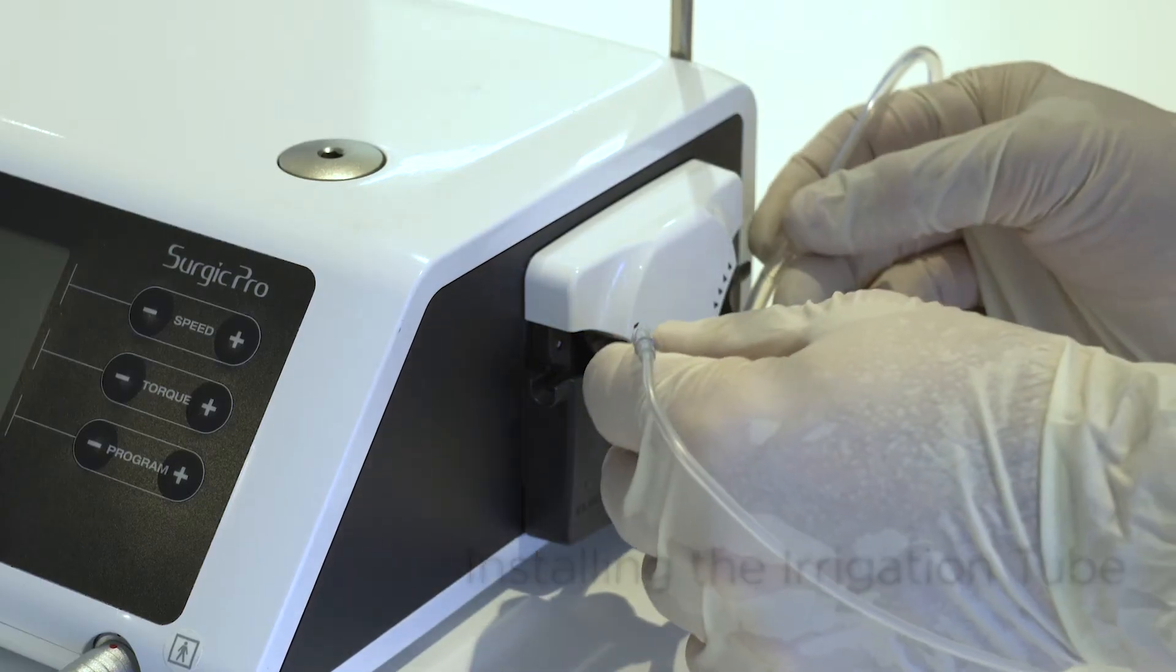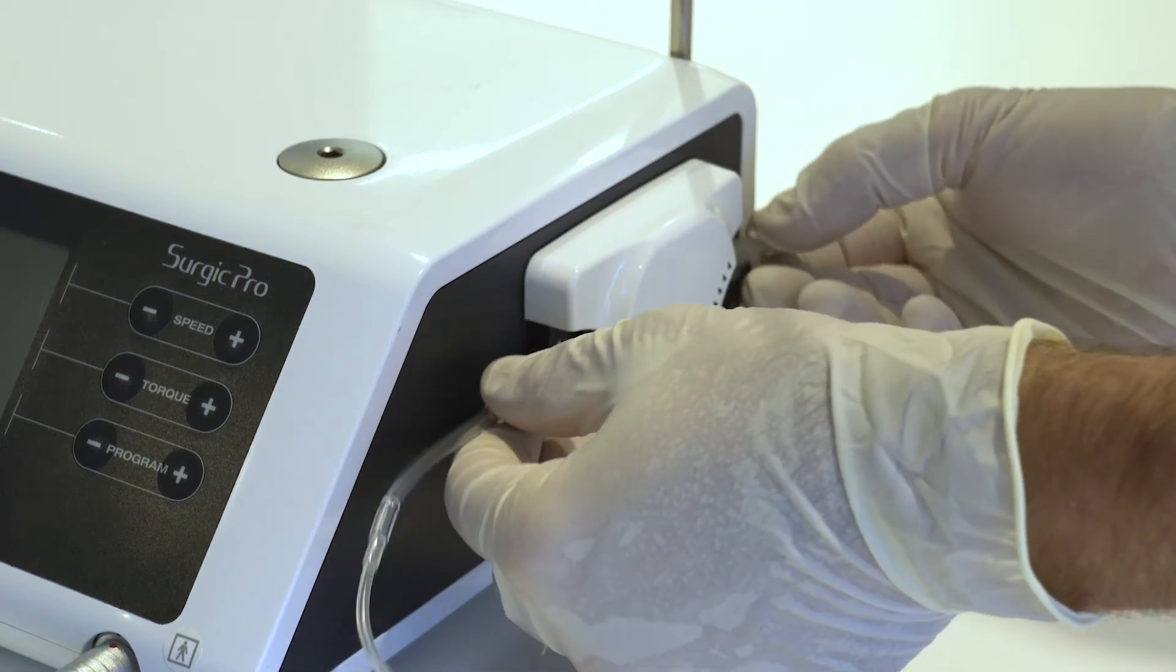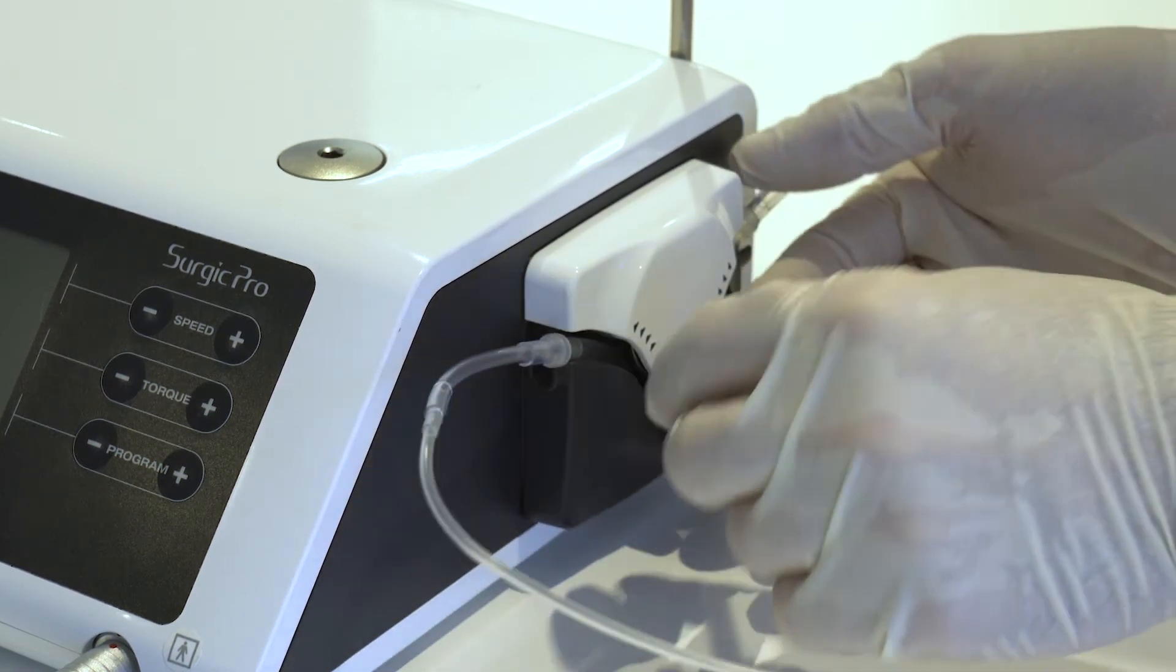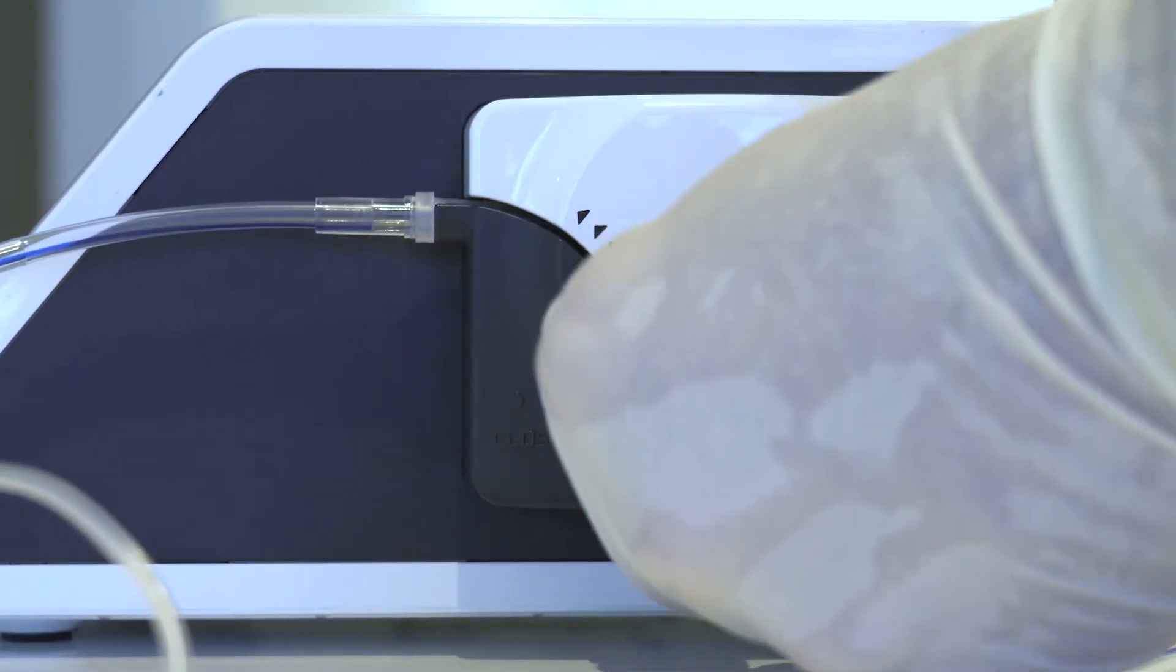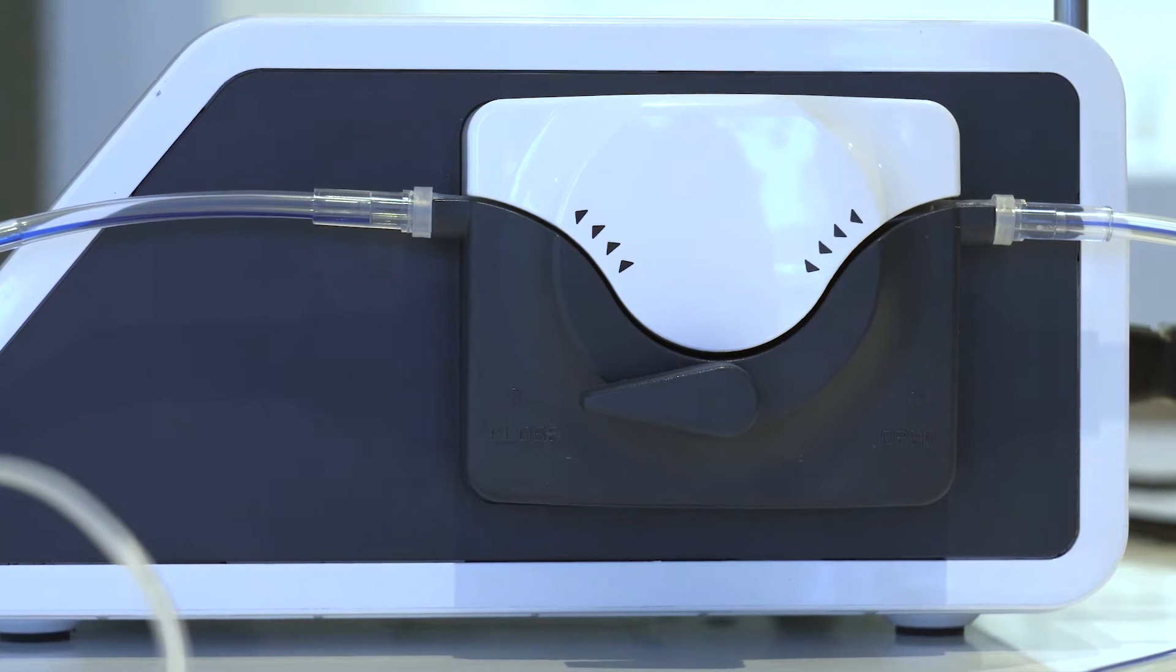Position the stoppers of the tube assembly in the tube guide securely. After the tubes are correctly positioned, close the pump cover by turning the pump cover lever to the closed position, 180 degrees counterclockwise.